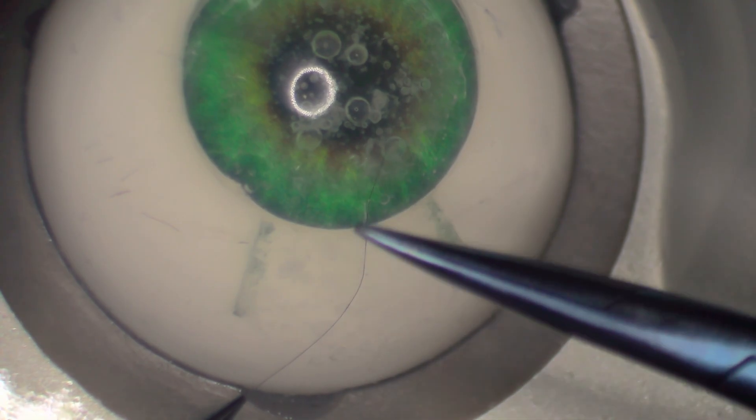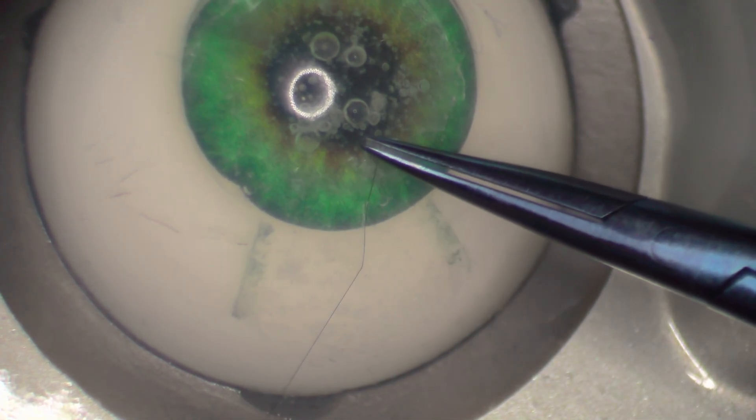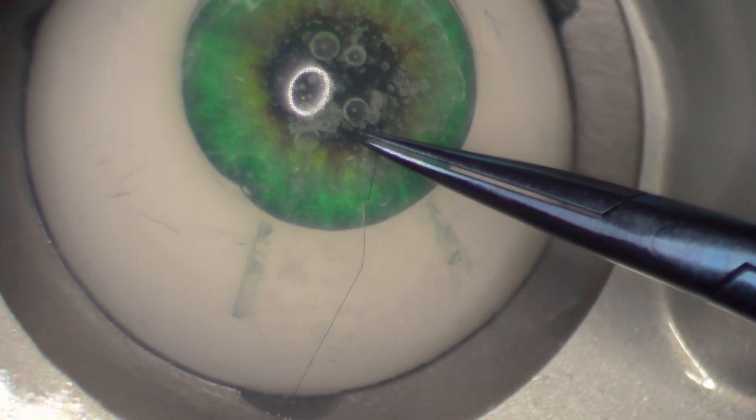When pulling it out, also pull with a rotation movement — don't pull it out tangentially. Step six: pull the suture through the wound and make sure you don't lose the short end. To better visualize it, I always put it on the cornea so it's in the same focal plane as the rest.